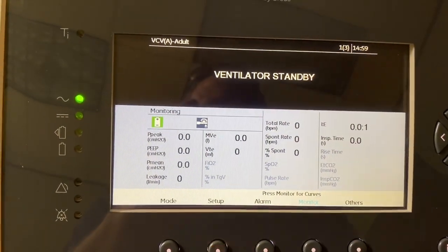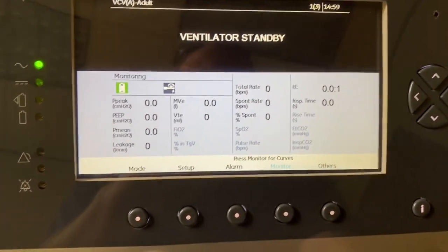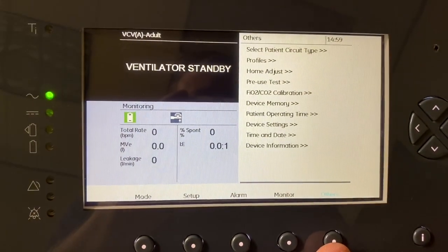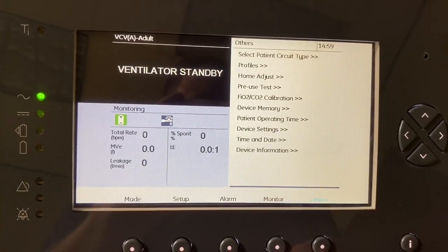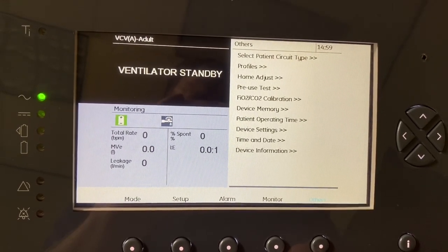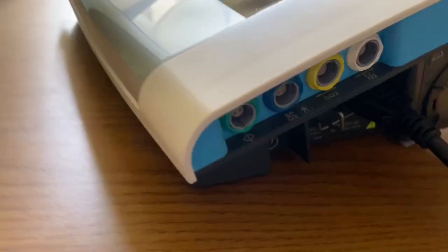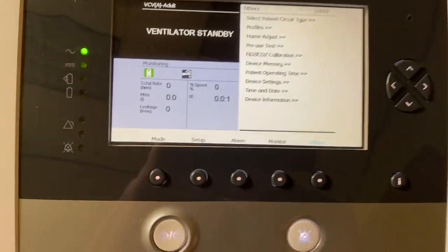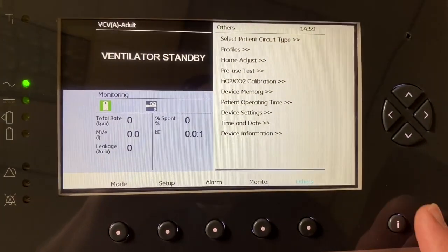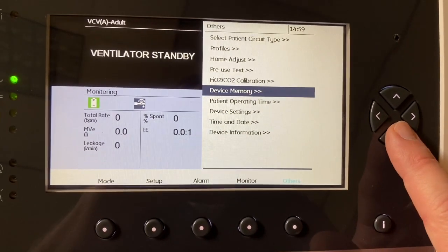Monitor will take you back to the home screen, and that gives you the patient monitors when therapy is being used. Others will give you some generic information about the patient circuit and the profiles. You could perform another pre-use test if you were using an FiO2 or CO2 analyzer — it does have the capabilities of having those analyzers connected. Not done in the home use, but could be useful in the hospital. You can change your date and time and all that in these options.